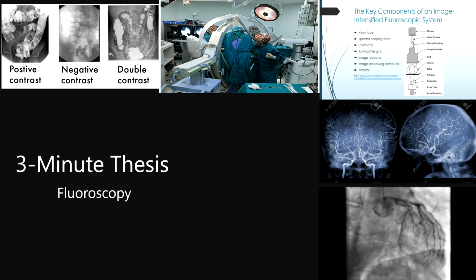There are certain advantages to using fluoroscopy. One of those advantages is that it provides real-time feedback, which allows physicians to watch the procedure unfold, as well as making instant adjustments. It's also considered cost-effective and more readily available compared to CT or MRI.